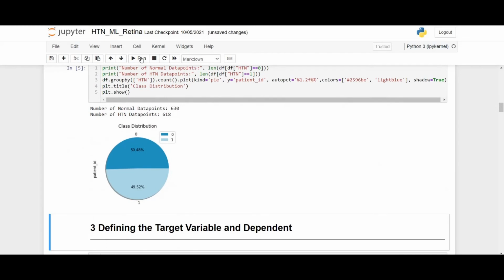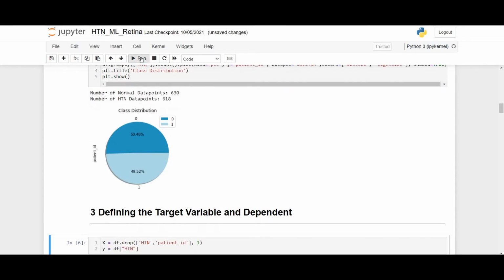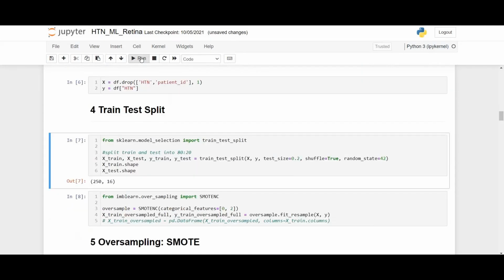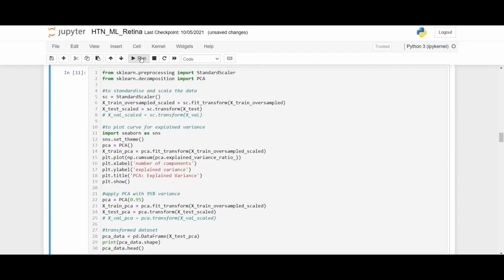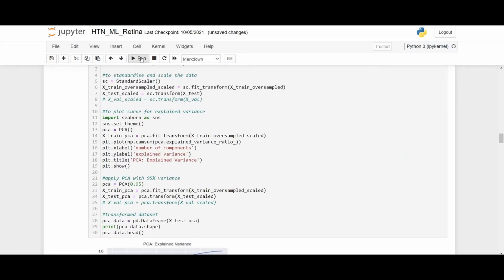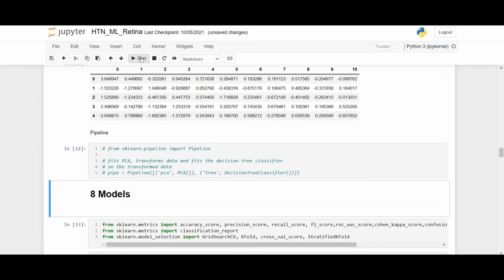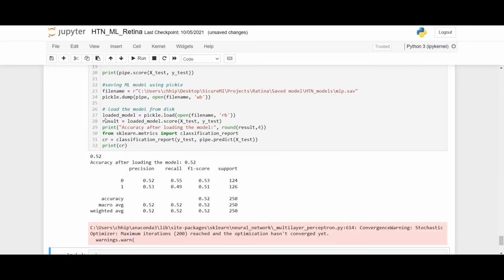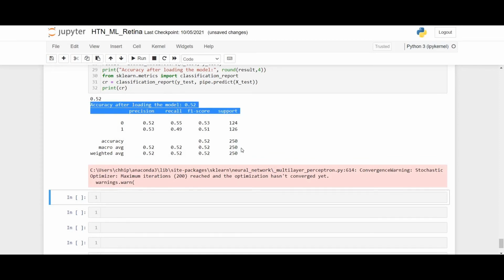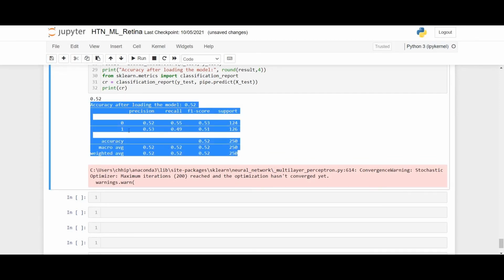As our class distribution is approximately 50 to 50%, in case the imbalance increases, we will use oversampling techniques to balance our target class. Then we are going to use standardization, PCA, and then we are going to train our machine learning models. This process will take about 5 minutes to train the ML models. The trained model will be saved in the htn_models in the saved model folder.